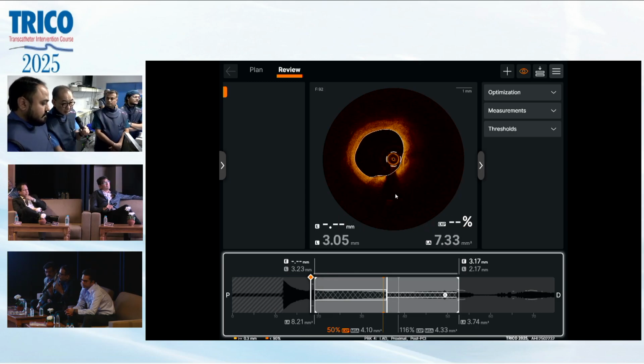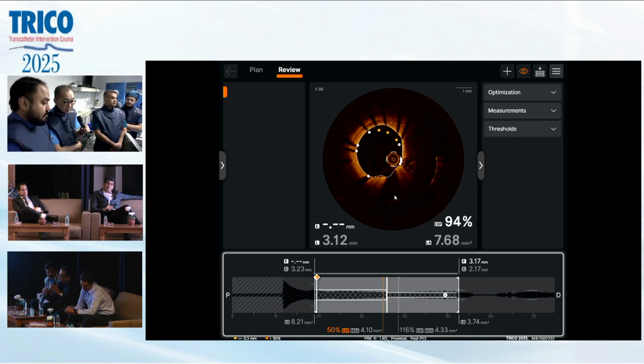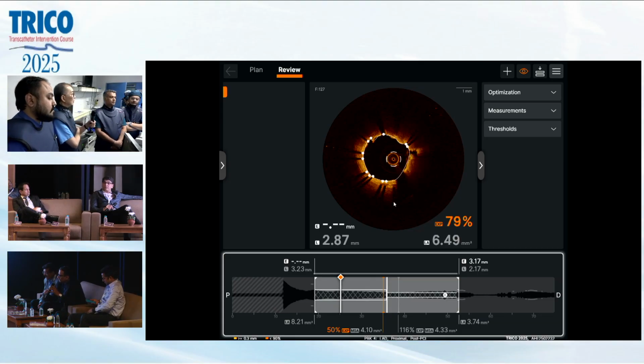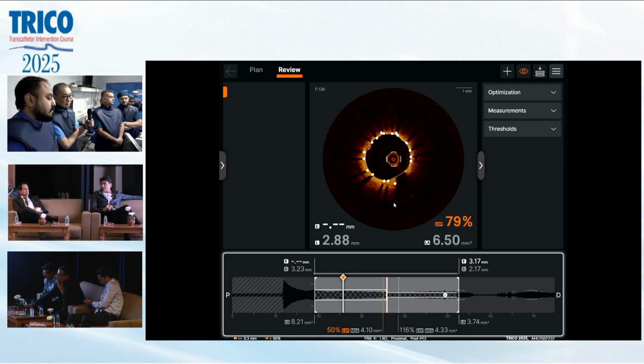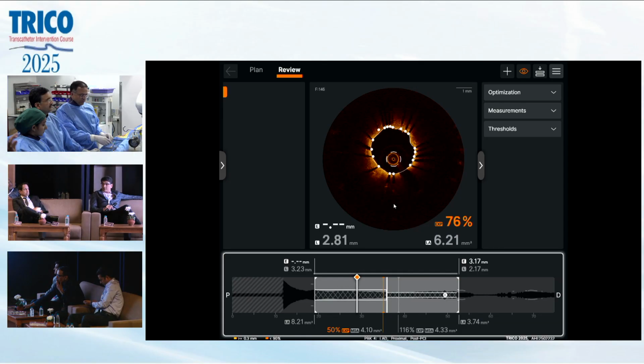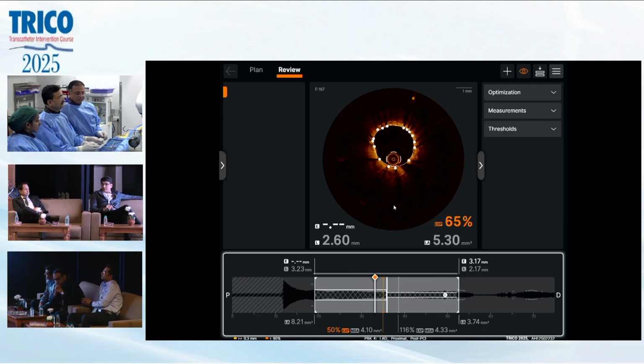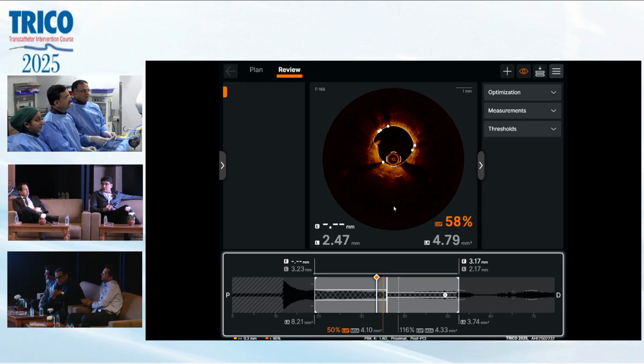As a conceptual thing, I'm just asking: is this the done thing, that you put in the stent and then post dilate it, or you prepare it and then put the stent? I think if there was adversity, preparation was our plan actually. We thought about atherectomy, scoring balloon, etc. But the OCT changed our mind.